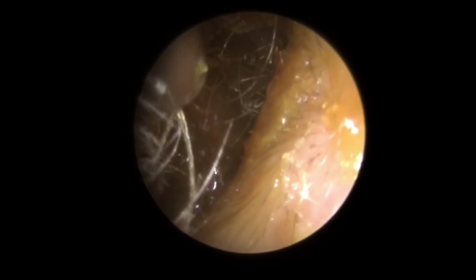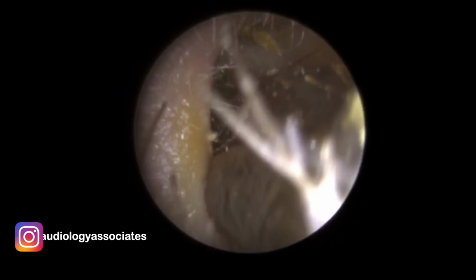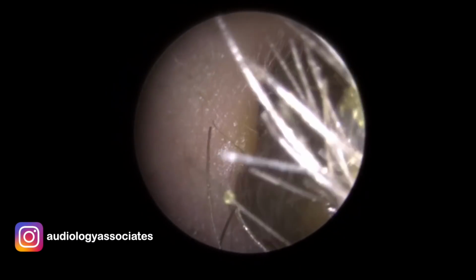There we go, just unpeeling from that left canal wall, trying to bend it around this entrance here. You can see you've got that little bend to the right, so we're going to try and bring it down, then flex it across to the right hand side to get it around the corner. Keep holding on to it, just looking for any smaller pieces we can suck inside the machine just to get a bit of purchase on this wax. Giving it a good wiggle, just slowing everything down here so you can see this popping out. There we go, out this wax comes.